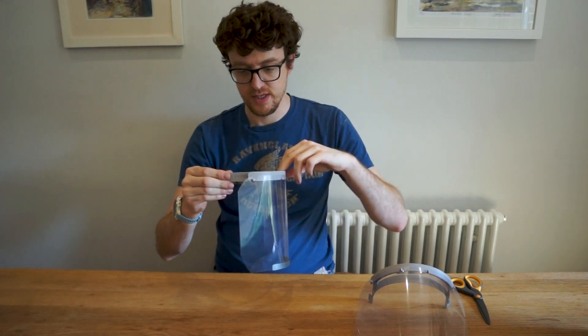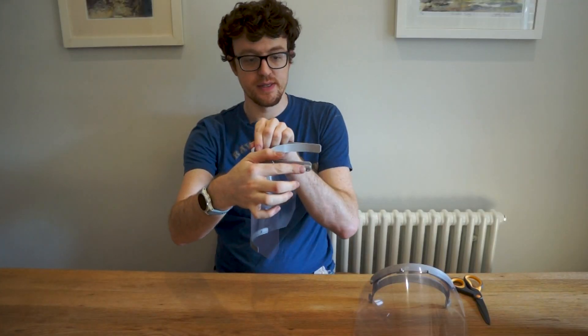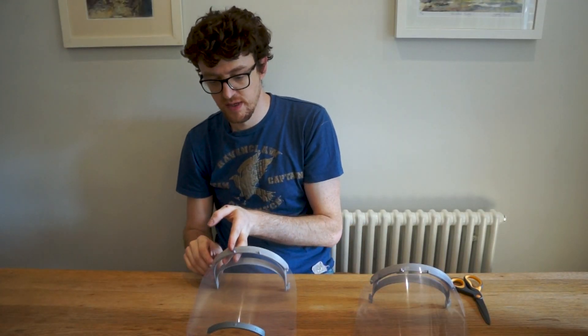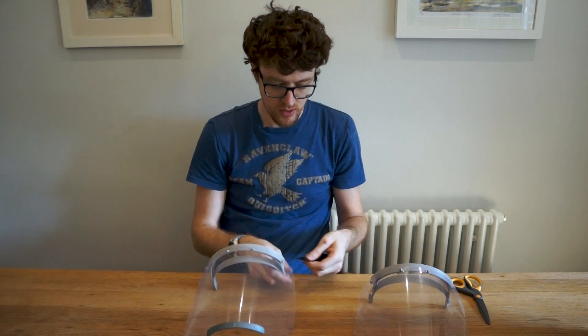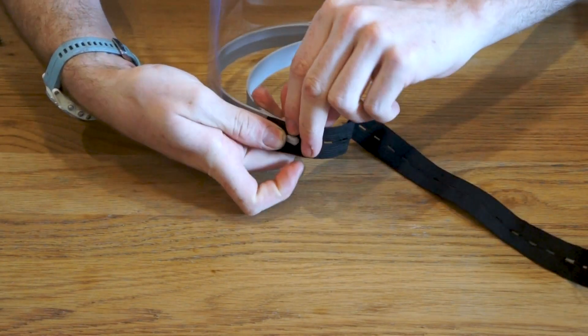The next part is getting the elastic strap on. You can see on each side there's a T-shaped part, which is what the elastic comes over the top of. Grab first the buttonhole elastic — just take one hole and put that over one side like so.